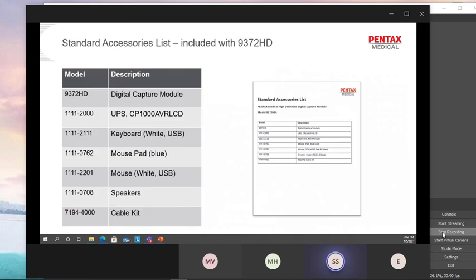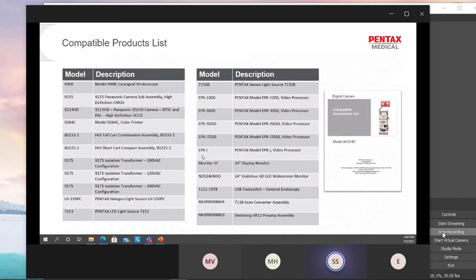All right. So this is for the monitor, and then there's also the foot switch. And here, for fluoroscopy use, if the site doesn't have a scan converter, you can use this. This is for your scan converter, right? And if somehow you need to use the strobe with the GPS system, then you need this preamp assembly unit. All right. So this is for fluoroscopy. This is for your speech.